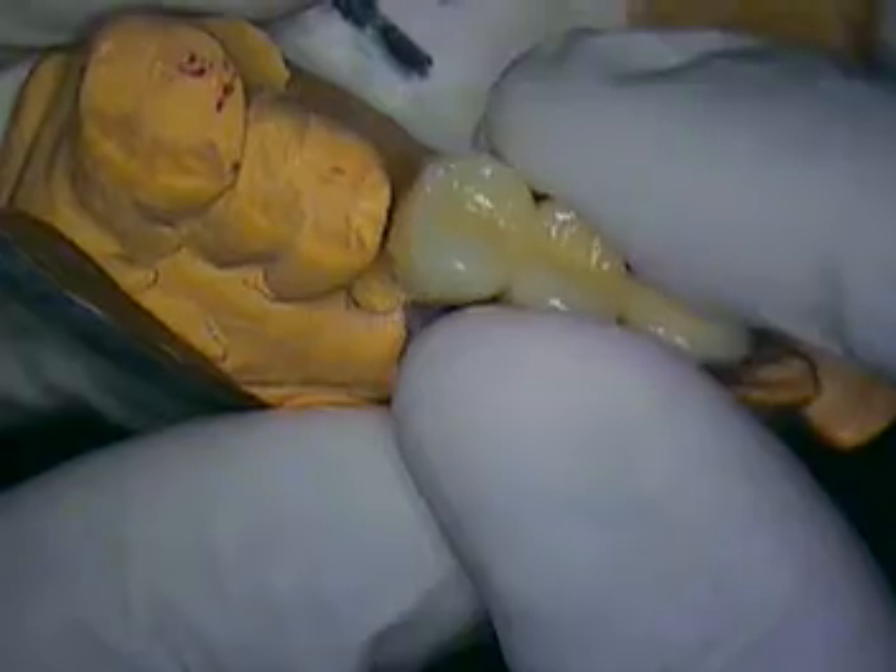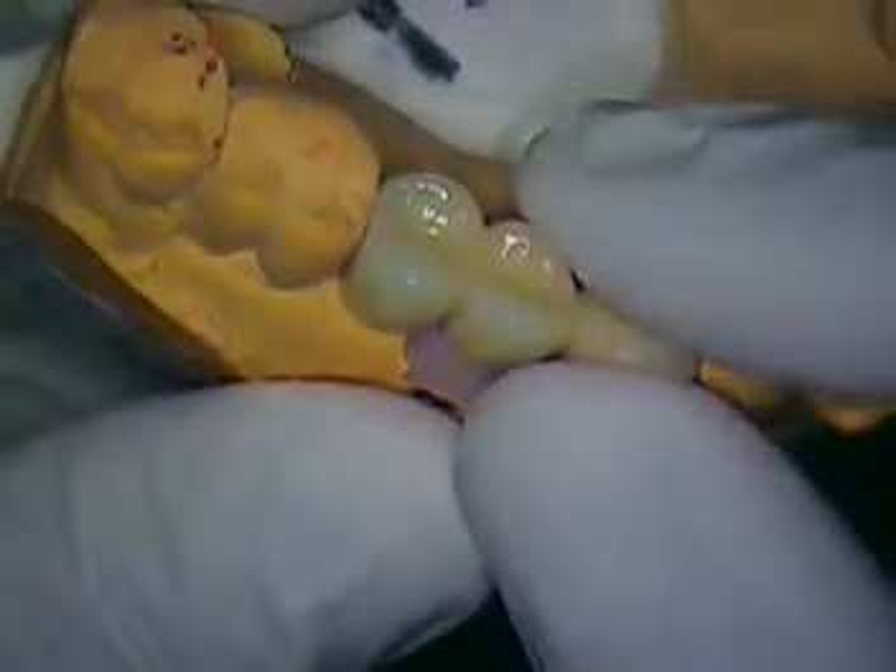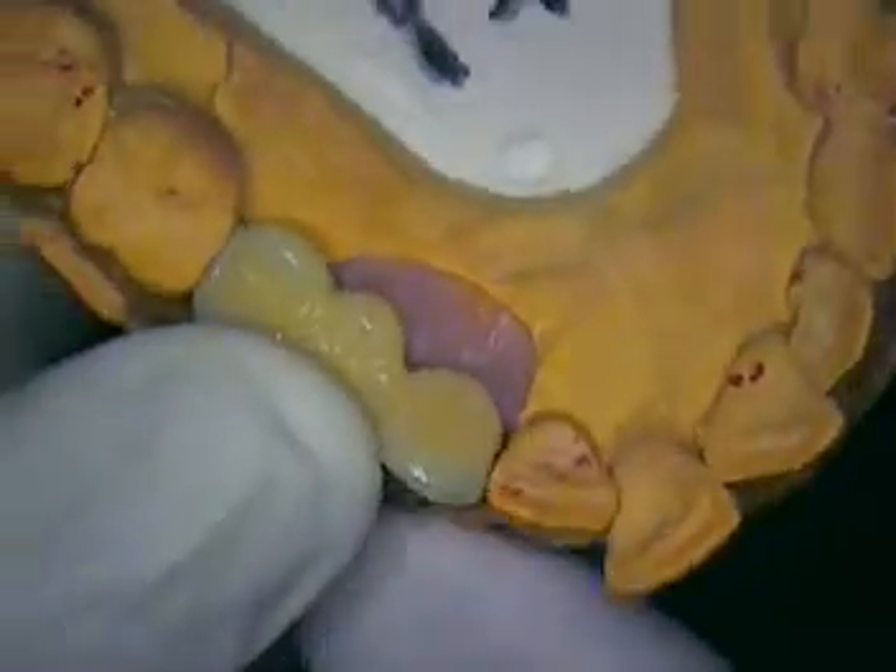So here we are. We're ready with the bridge to be cemented in place. It'll be a three-unit cantilever bridge. The interesting part about this case is that we want to correct a little bit of the occlusion as well. The patient's lower left cuspid was a little deficient on the labial aspect, so we added composite to that surface on tooth number 22, so that when we do get some disclusion from both teeth numbers 11 and 12, we'd like to have them both uniformly function together.